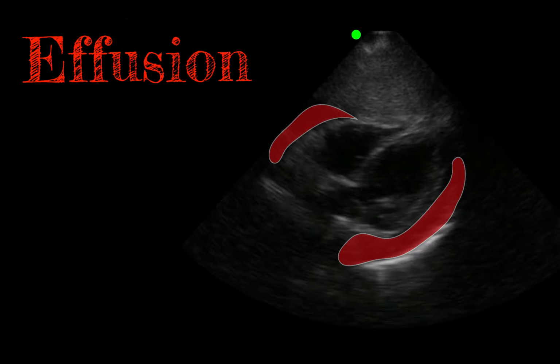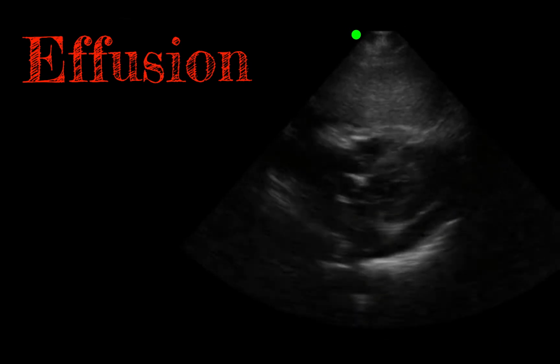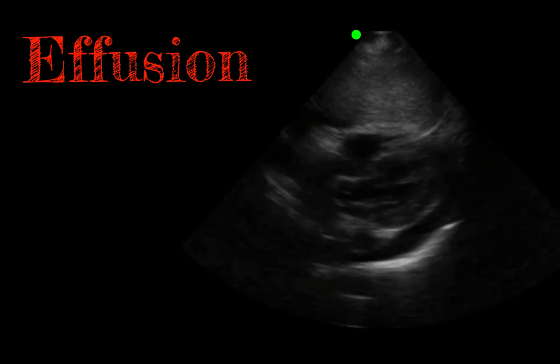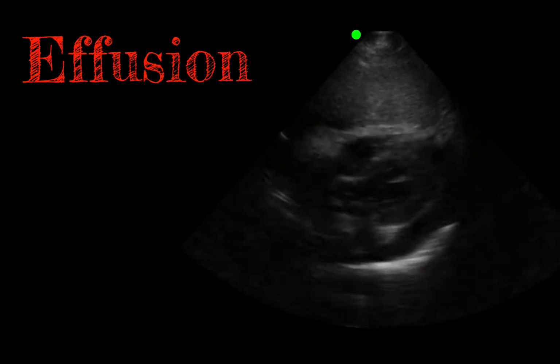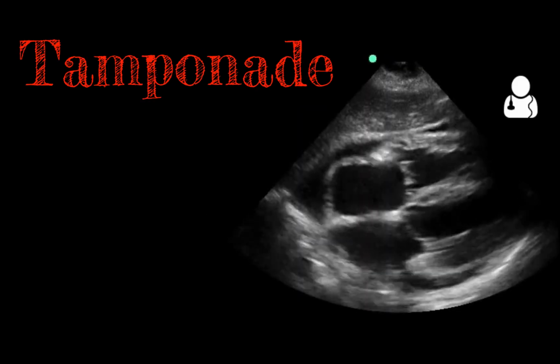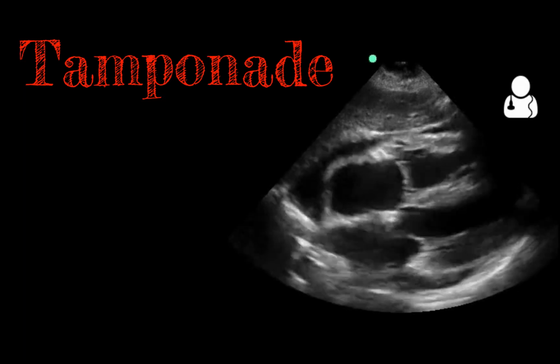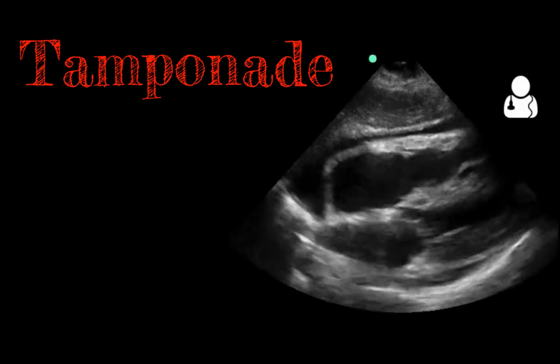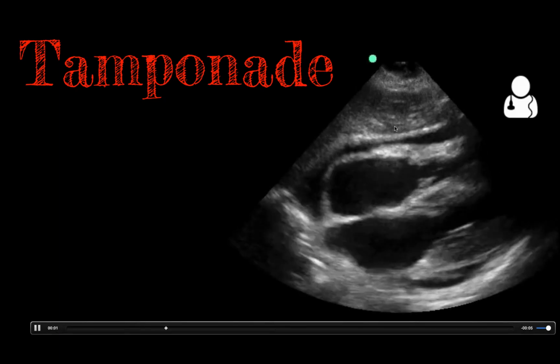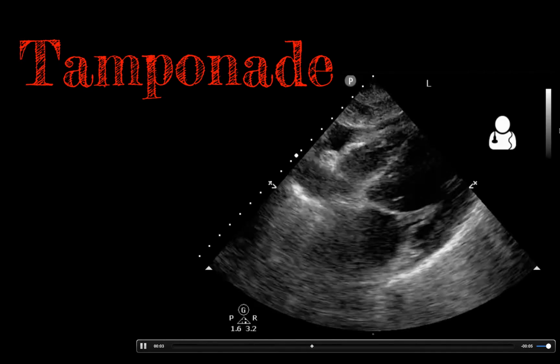Once you've identified the free fluid, take a close look at the right ventricular free wall closest to the near field and watch for collapse of the RV during diastole, which represents impending obstructive shock due to tamponade. Here, you really don't see very much RV collapse, but here's an example of early tamponade. Note the bowing of the ventricular free wall just at the end of diastole. This is sometimes referred to as a trampoline sign because it looks like someone is bouncing on top of the right ventricle. Here's a more obvious video. Here, the RV is almost fully collapsing at the end of diastole.